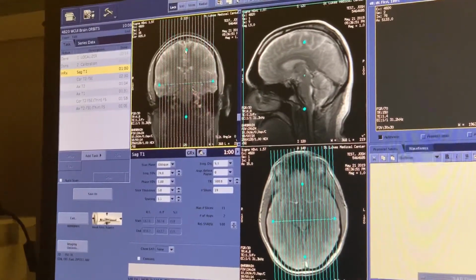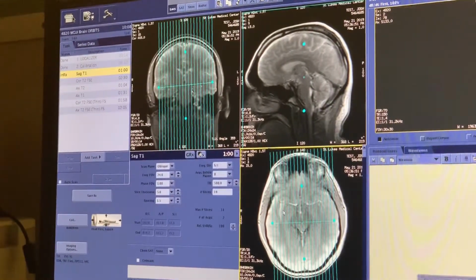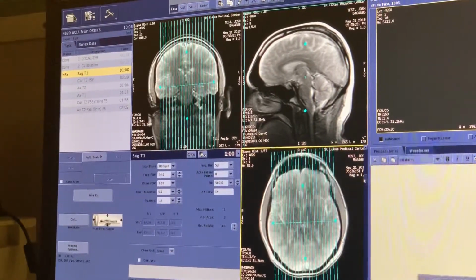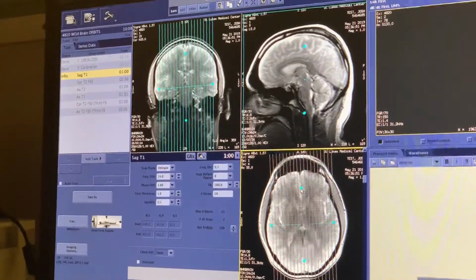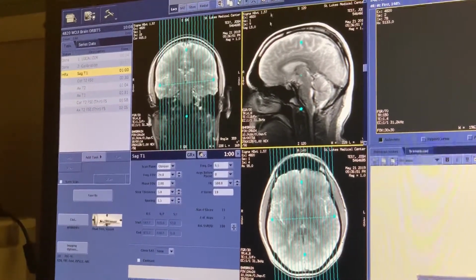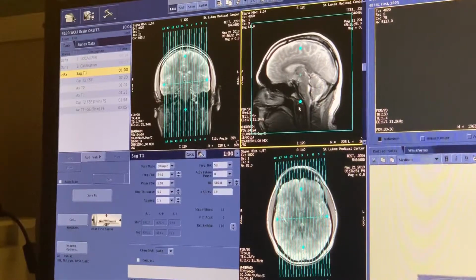So now I'm going to angle in 3 planes. This first angulation is good. Come over here, make this a little bit more contrasty. If I can't really appreciate the falx that well, I can move these, find a slice where I can really see that anatomy, and then I just basically line up with it. Something like that. And this one, I can't see the exterior box, so I'm going to hit subtract. I don't really have to angle at all, so I'm pretty happy so far.